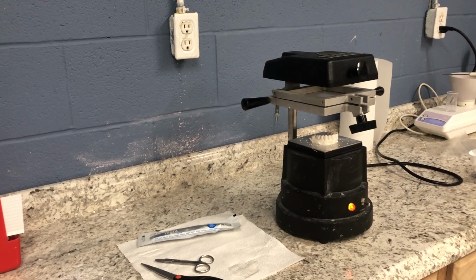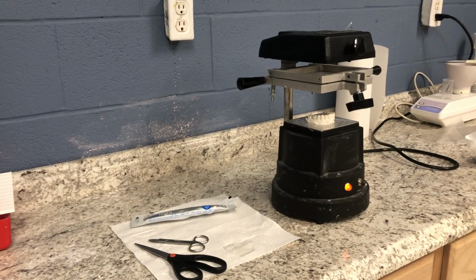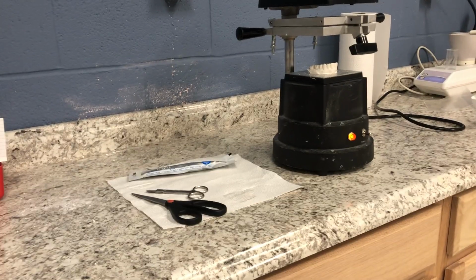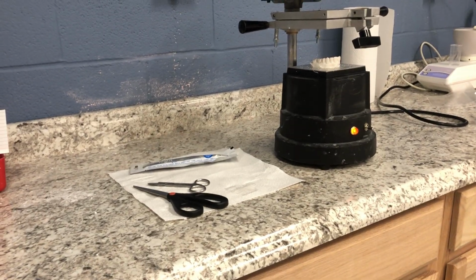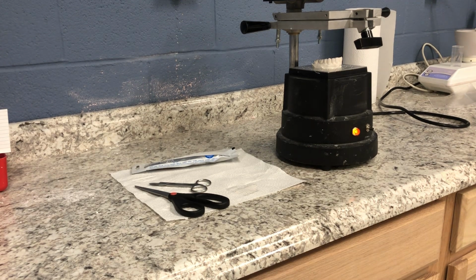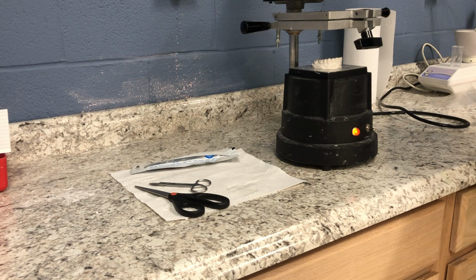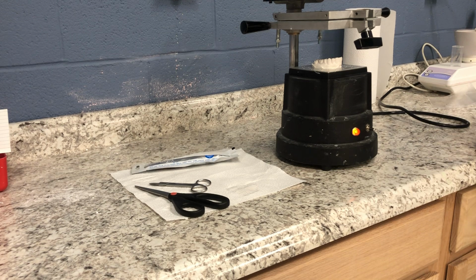Now, while you're doing this, you kind of want to get level with the machine and see it actually dip down a little bit. So I'm going to try to lower this so you can see it. And it kind of looks like someone's sitting in a hammock. So I'm going to get down eye level with it and just kind of check. And as soon as it reaches that point, then we're going to go ahead and turn this away, turn the suction part on, and pull it down.